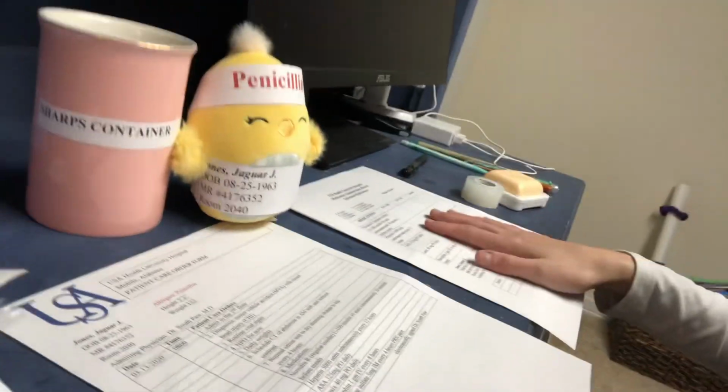So first I'm going to show my space. There's no one here with me. I'm going to show I have my medical administration record, my chart here, all my stuff for my patient room, my syringes to select from, my medications to select from, and I am prepared.